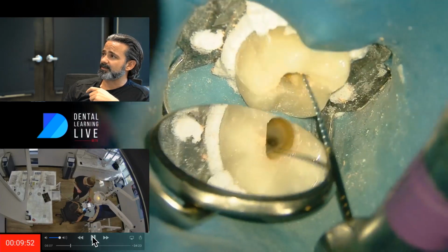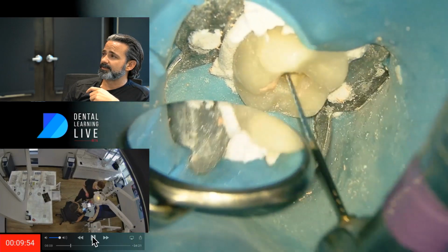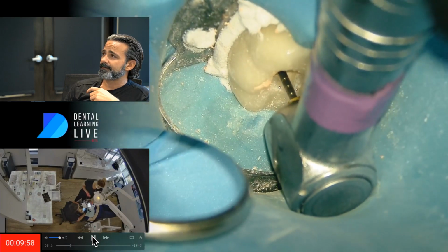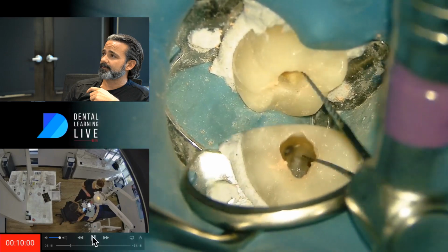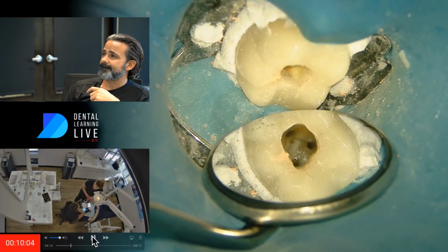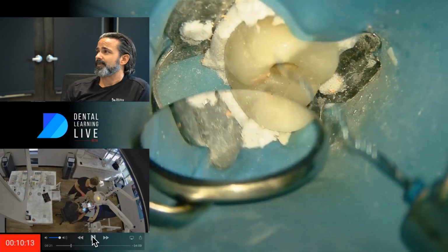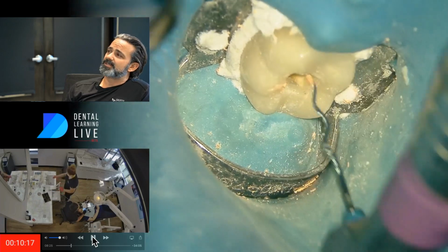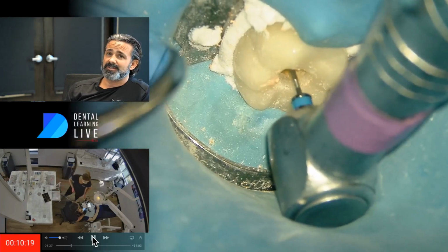All right, so picking through here. Now, the 3D shaper, I really like this because, like that, you'll find extra gutta percha in there.